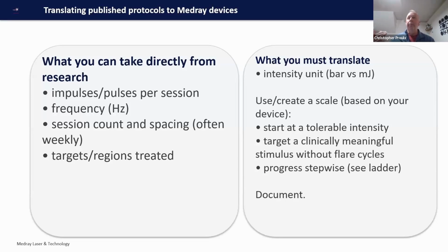Here's the other challenge. Chris, I saw a new piece of literature come out for a condition that I'm going to start treating, whatever the case may be. Can we create that? And the answer is yes. I would probably never buy a device that didn't allow me to manipulate that. At least in the clinic unit, I get some of these portable ones that can be nicer, to just press a button. And we still have all that as well.